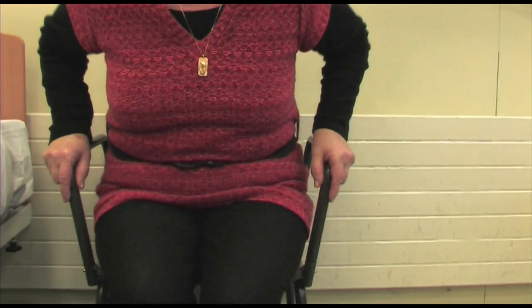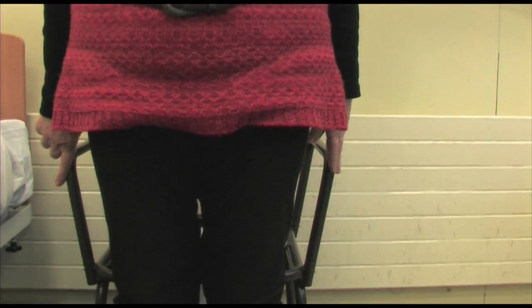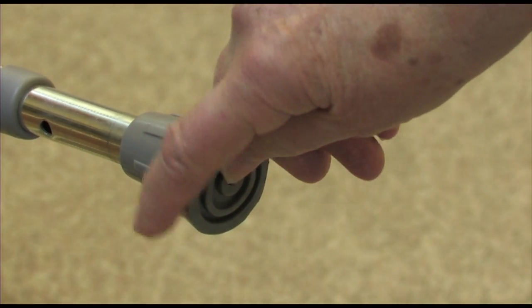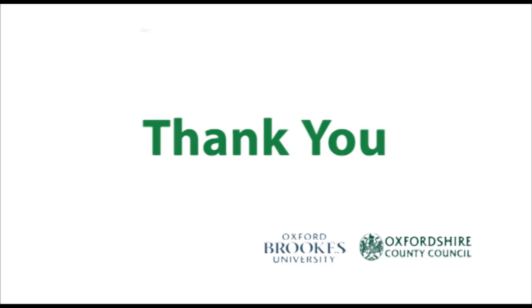To stand up, make sure you place equal pressure through both handles to avoid movement of the commode. Remember to check your equipment regularly. If available, always check any instructions provided by your supplier. Always seek assistance if you're having difficulty.